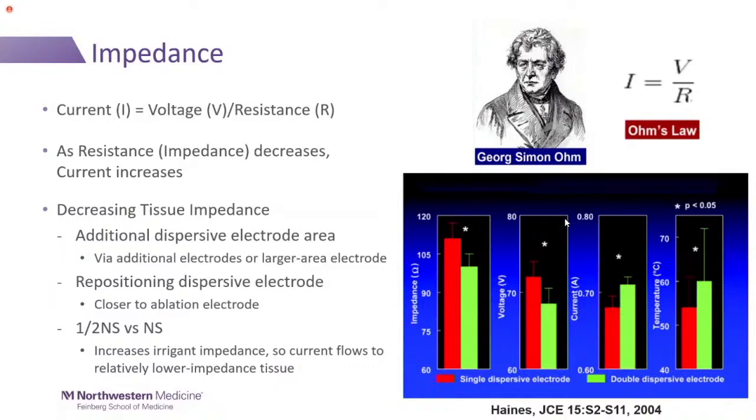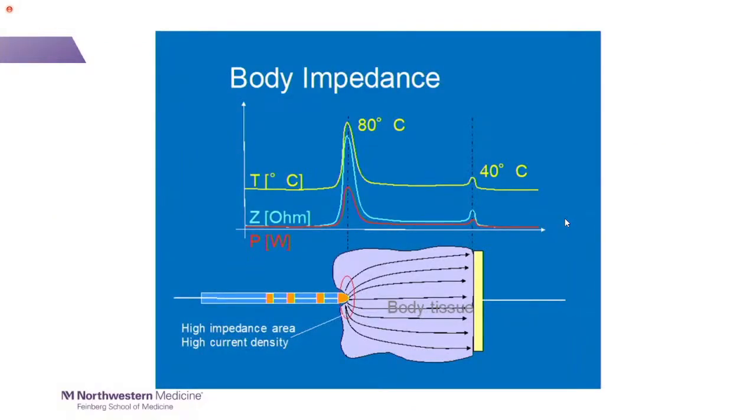All right, this is a nice graph just showing that if you put 2 patches on, like in green, you can increase your current delivery, okay? All right. So fascinating. Okay, so let's talk a second about the dispersive patch because this is really important.